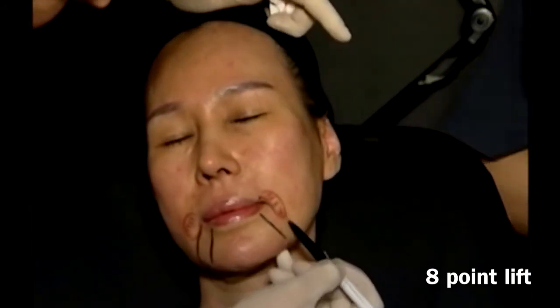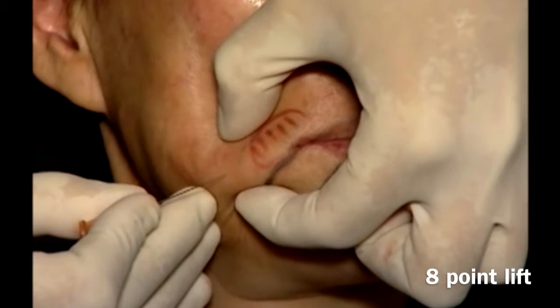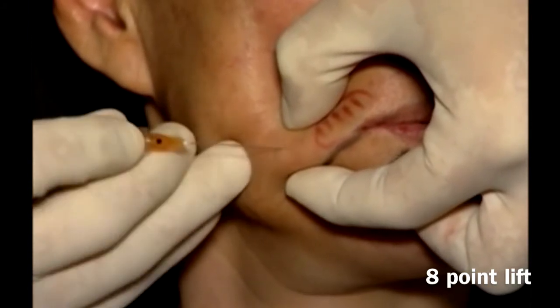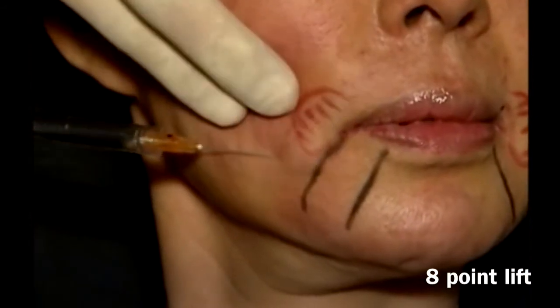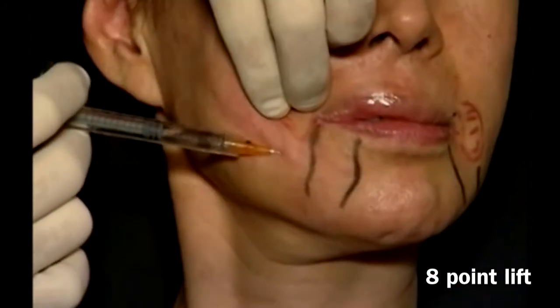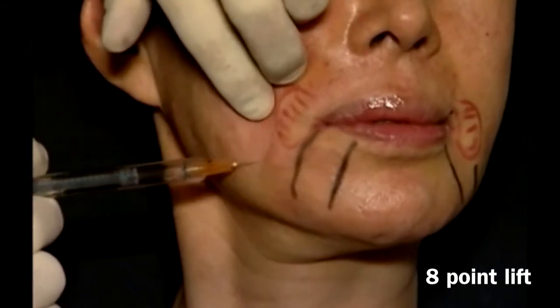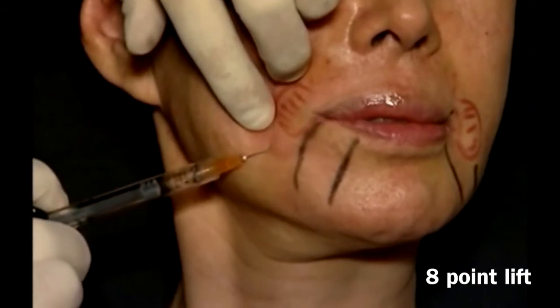Now mark the retruded chin, pre-test with a cotton bud, entry point with a 25-gauge needle, and use Voluma with a 25-gauge cannula. Stretch the skin and direct to the area of volume loss. Proceed with fanning technique, or retrograde and anterograde, and deposit the product in multiple layers.